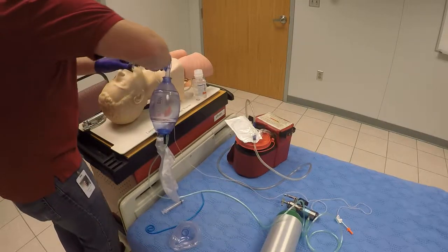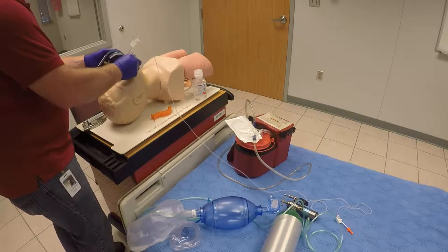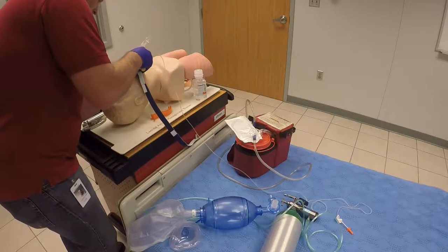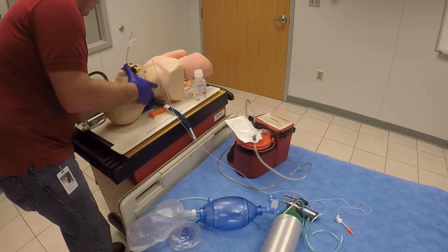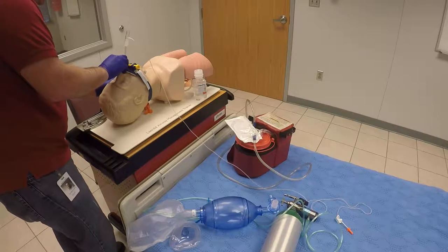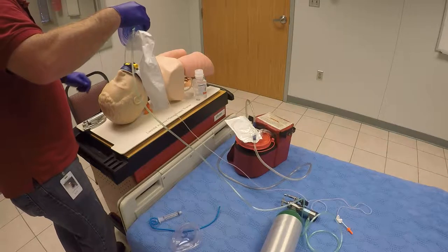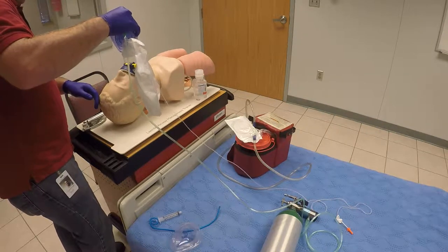You'll secure the ET tube. You can direct your partner to continue ventilations while you secure it. Note your depth on the ET tube — it's going to be about three times the size of your tube, so our depth at the lips is 21 and we used a 7.0. Secure that in place. Your partner is still oxygenating the patient and you can go ahead and set them up on a vent or whatever might be necessary. Once secured, double check your lung sounds to make sure you have bilateral lung sounds and the tube didn't shift. Watch your SPO2 readings.